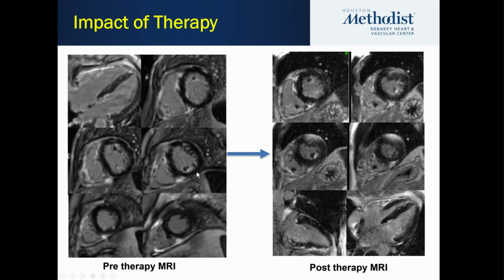And these were done in 2 different machines. So there is some interstudy variability, but you can see that there is still late gadolinium enhancement in this patient, despite no active inflammation. So the late gadolinium enhancement either takes longer to at least regress a little bit, or may never go away, depending on what was the etiology of it, whether it was a scar versus edema and increase in the extracellular volume.